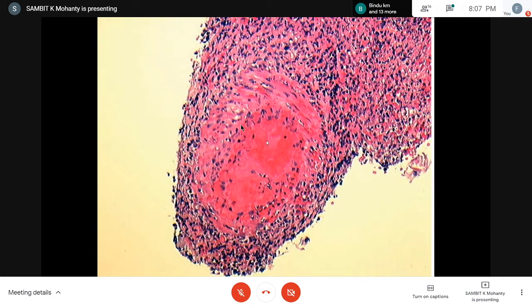And honestly speaking, when I looked at the case, I could not see the mitosis that readily. Even in the thinnest section, mitoses were not readily discernible. So anything benign you think in this case? I mean, you all are in the differential, great differential. Vasculitis. Yeah, that's a possibility. Great. Let's see.